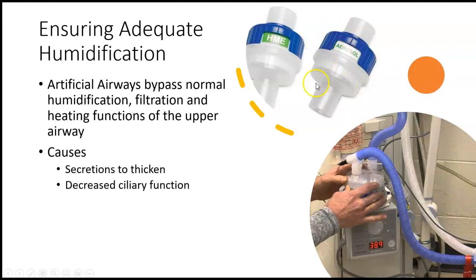These HMEs sit right at the beginning of the airway, right between the patient and the Y adapter. So right at the patient airway. A lot of times these can get clogged with a lot of humidification, where they get really, really wet, and that can increase airway resistance and obstruct the airflow. And a lot of times patients will cough secretions and things like that, and then these get clogged with secretions, and that can also cause an obstruction or a partial obstruction to the airway.